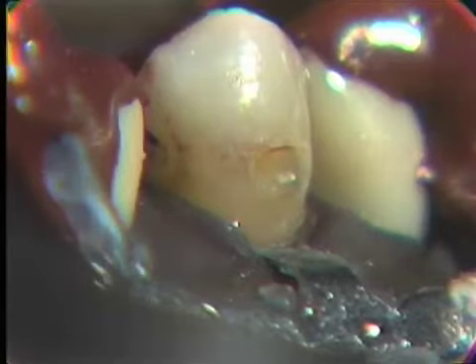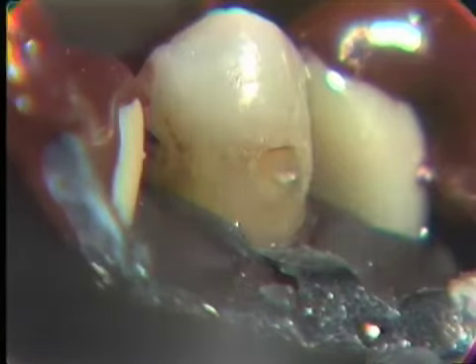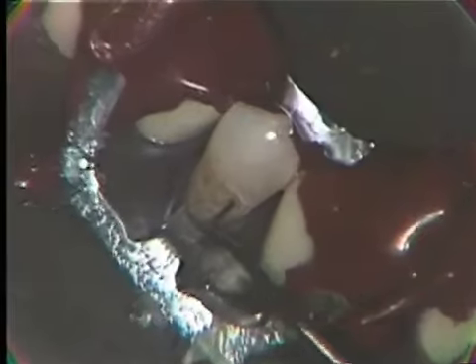In the laboratory, you'll have to use cotton pellets and cleanse your cavity preparation with your cotton pellets. And then with your chip blower, dry out your area. Now you have a good chance then to observe the outline form that you've established at this point.